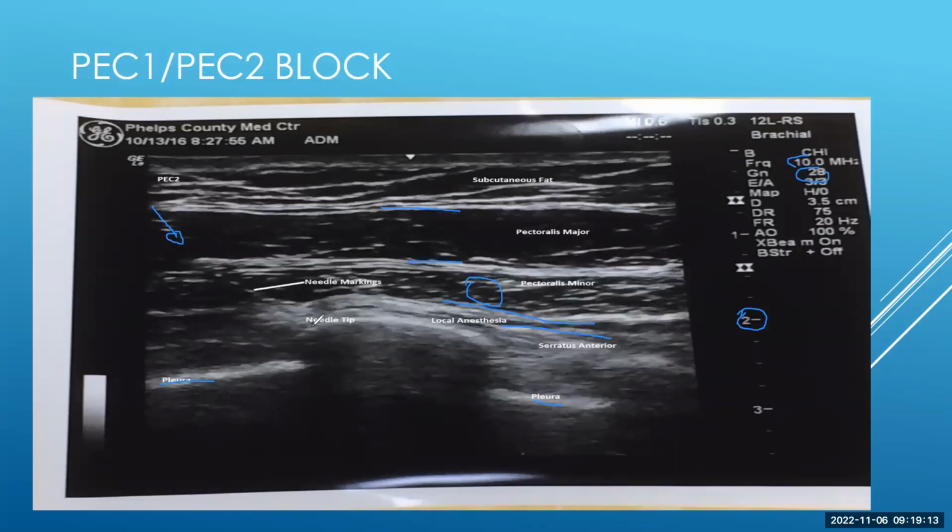So as the needle came in contact with the rib, as you can see there, we injected local anesthetic and basically start filling up this space. And we can see how this nice line that I'm not drawing very well is starting to fill up with this dark substance. So it's fluid. It's local anesthetic, and that's absorbing the ultrasound waves and coming back as anechoic. And that's excellent. That means that the injection is not going intravascularly. It doesn't mean that you won't have intravascular absorption, that's another issue, but you're not injecting directly in a vein.